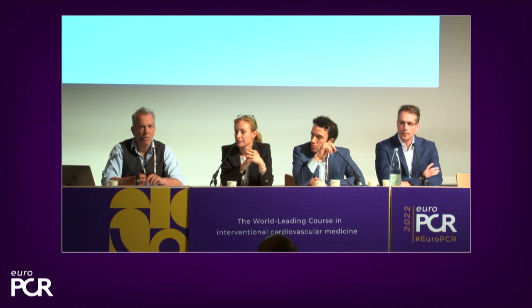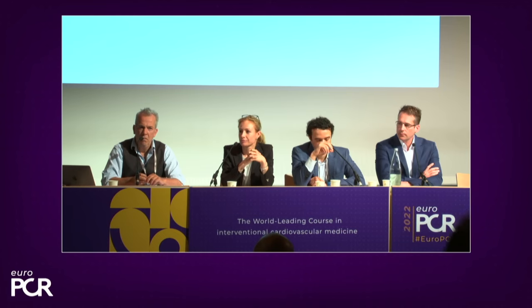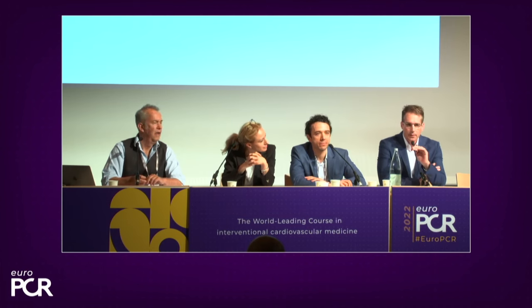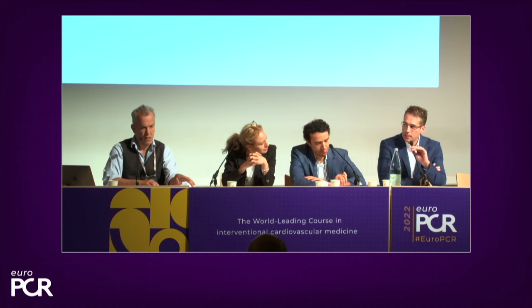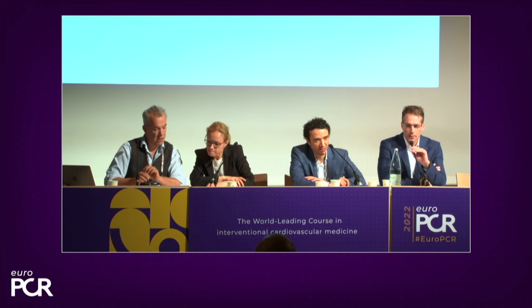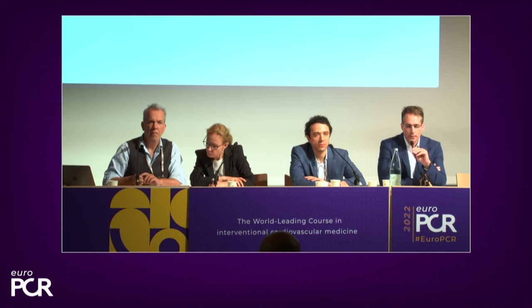Yeah. And obviously, when we do a TAVI, it's more than just get the job done, get the valve in, and go away. You also have to be sensitive to the coronaries. So, Steffen, what is your approach in younger patients to the coronaries? Go quick and dirty, get that valve in, or pay some attention to other aspects of the implant? Yeah, so the first consideration would be your valve choice, because the low frame valve, such as the Sapien, makes it a lot easier to engage the coronaries. It is still possible with an Evolut valve, although it might be a little trickier. But in the vast majority of cases, it is still possible.